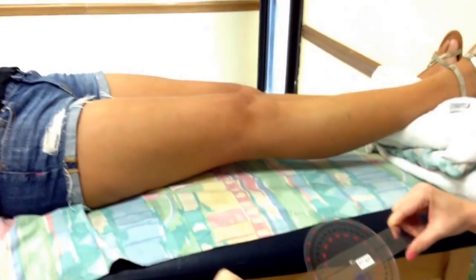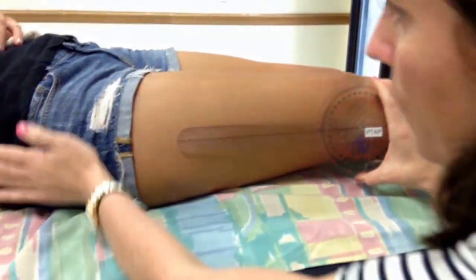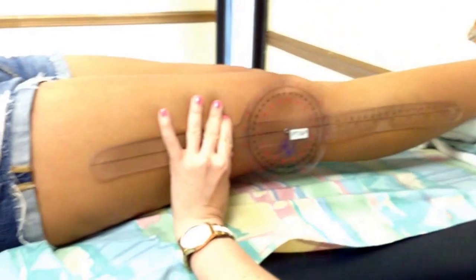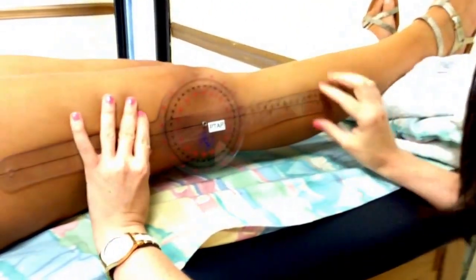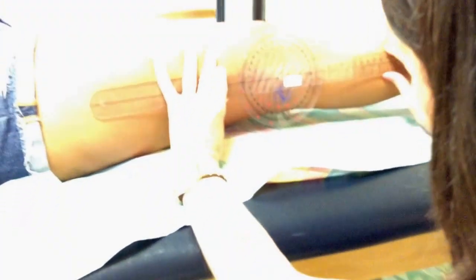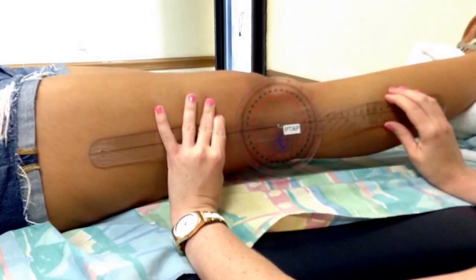Our goniometer fulcrum is going to line up with the lateral epicondyle of the femur. The stationary arm is going to line up with the greater trochanter of the femur, and the moving arm is going to line up with the lateral epicondyle of the femur. We would say, 'I want you to push your knee down into the bed.' She's got zero degrees, and I don't see any hyperextension at her knee.